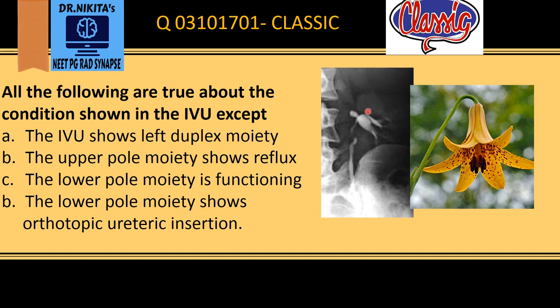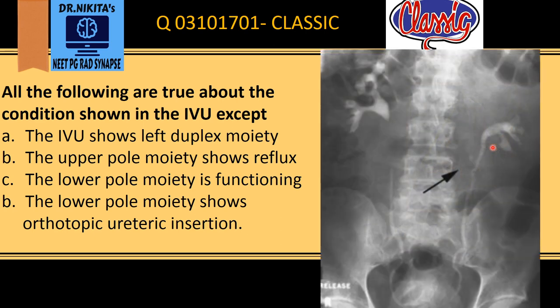Because of this pressure from the upper pole moiety, the lower pole moiety starts drooping. This drooping of the lower pole moiety gives rise to the sign called the drooping lily sign, which is seen in duplex moiety. On this IVP image, we see the lower pole moiety drooping down because of pressure from the upper pole moiety, which is not opacified.